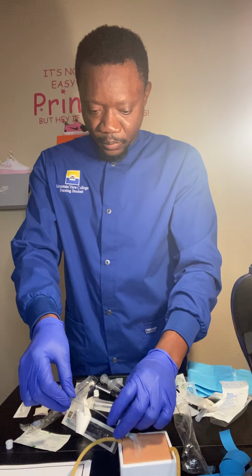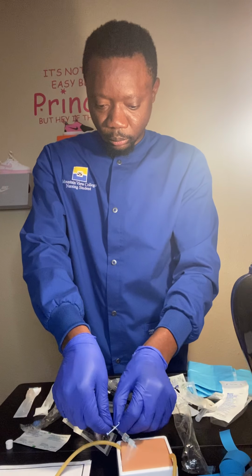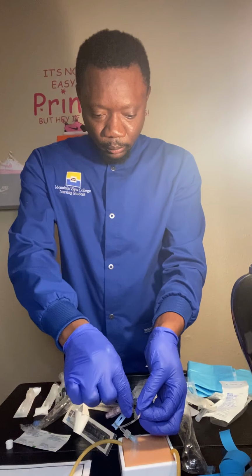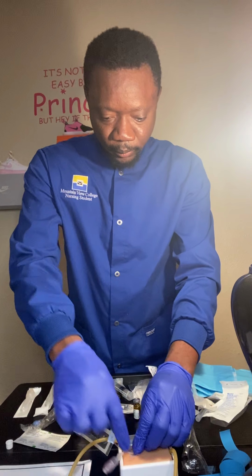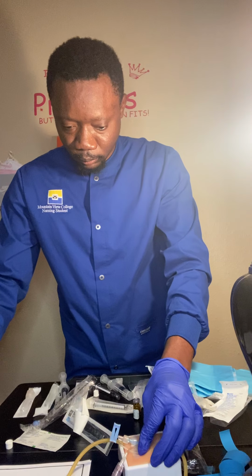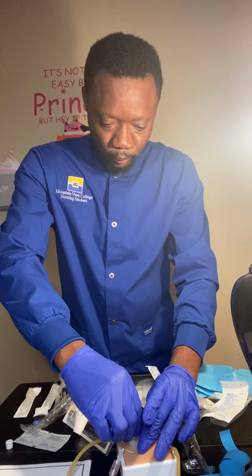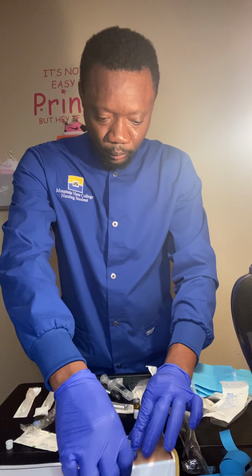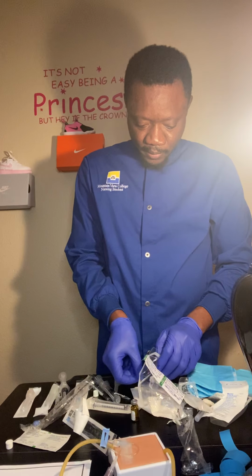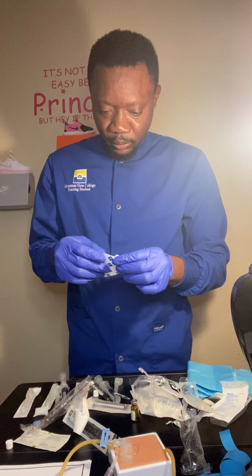Then at this time, I should go ahead and secure my IV. The tip. Okay, and after I've administered my medication, I'll get this, my Tegaderm.